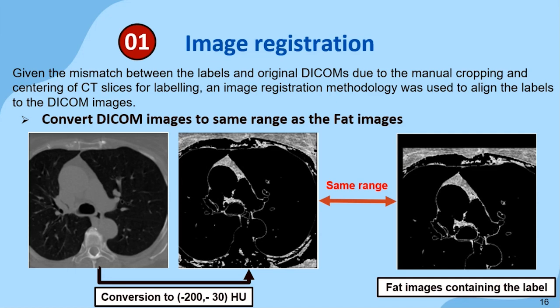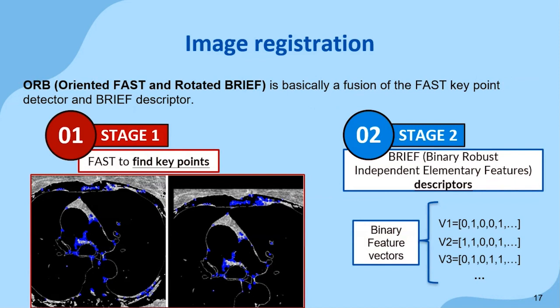Basically, there are two main definitions to keep in mind: key points and descriptors. The key points are simply points that stand out on the image, representing specific patterns or particular features, which are unique and can be easily tracked and compared. Descriptors, as the name implies, describe the features found to compare them with other images and find the same characteristics, being able to align them.